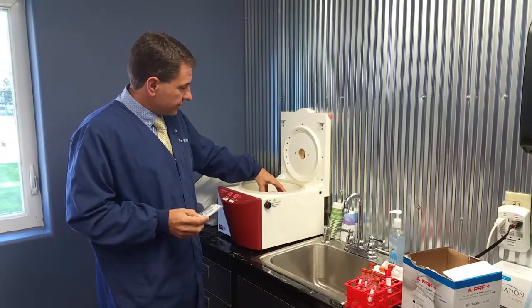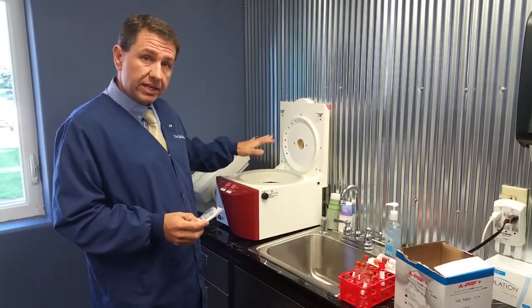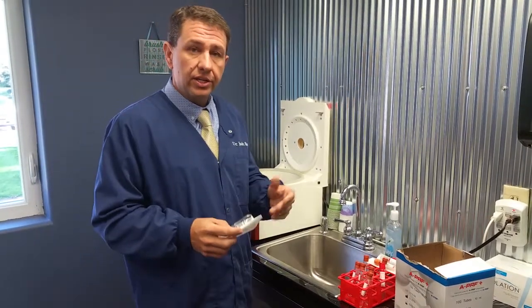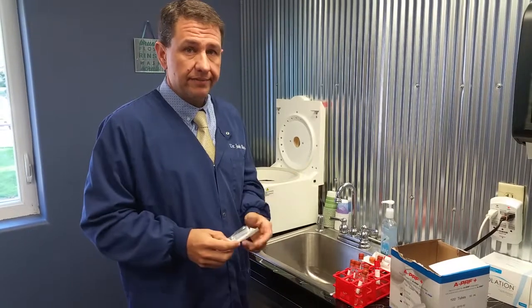One of the last things to know is that when you collect your material, immediately get it into the machine. If you don't get it into the machine immediately, you will get a very, very, very small plug. Those are my tips for today. Thank you.